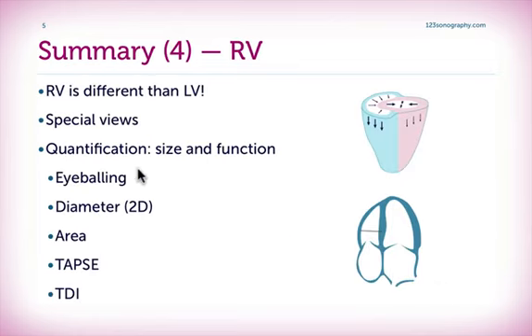The right ventricle is different than the left ventricle, both with respect to the anatomy and the function. Remember, we have a more longitudinal contraction of the right ventricle. We need special views to visualize the right ventricle.